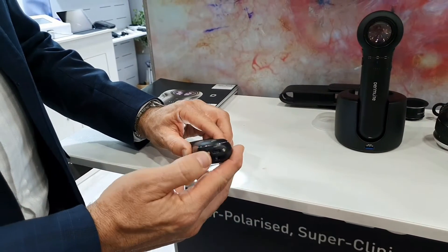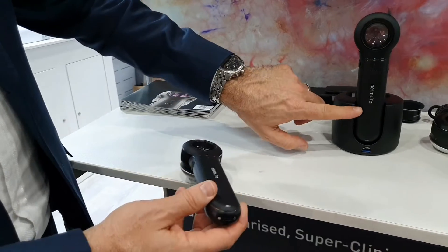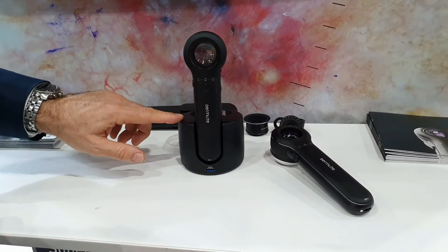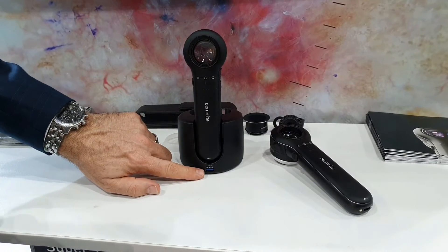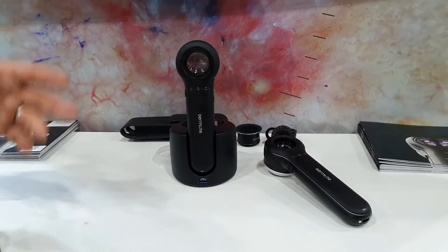We've also got a USB charging port on the bottom. You can charge with a cable or sit it in the included charging stand. There's also an additional USB output on the front of the stand that you can use for charging a different Dermatoscope or for charging your phone.